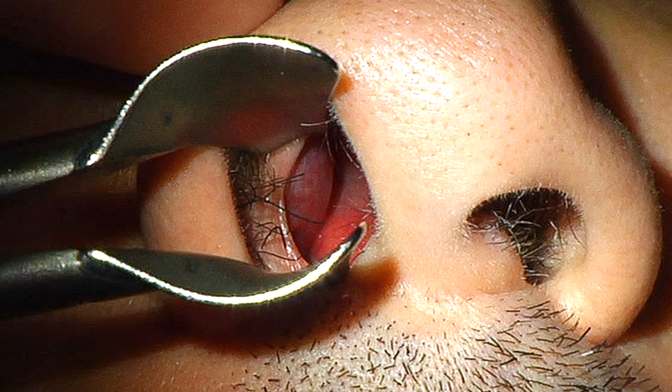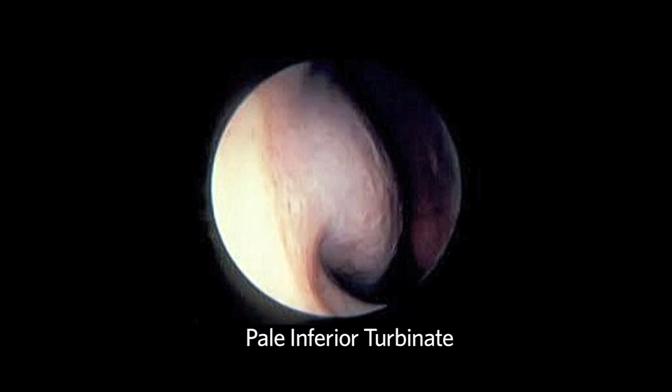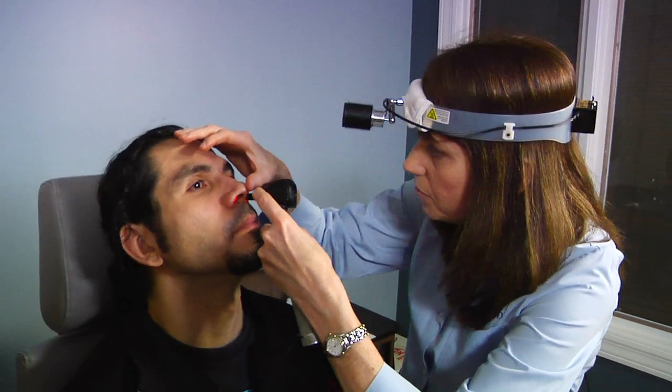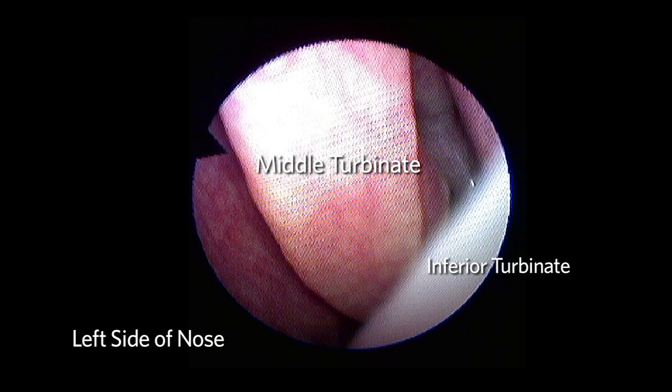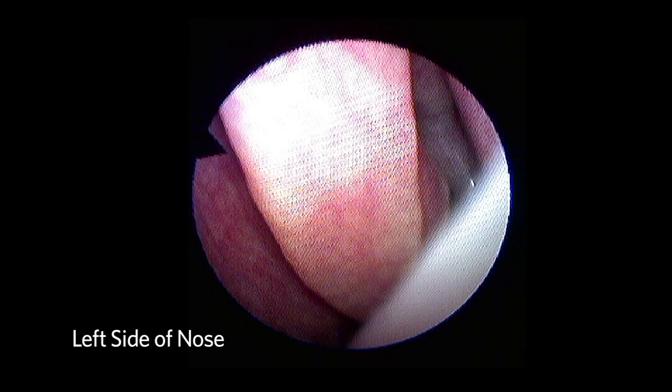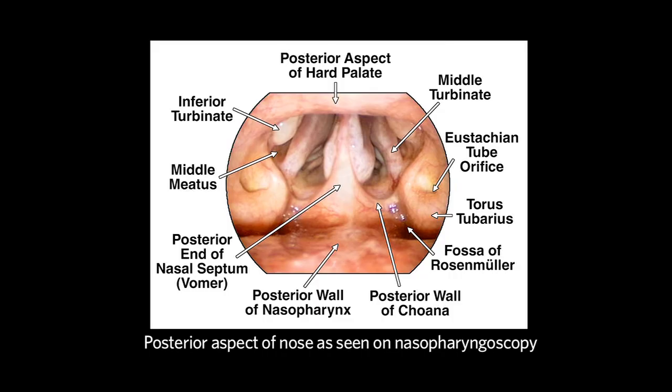The turbinates tend to be pink in color. If erythematous, it tends to suggest inflammation. If it appears pale blue, allergy should be suspected. If you use an otoscope with a large nasal speculum, one can often get a better view of the posterior aspect of the nose. This includes the posterior aspect of the nasal septum and the middle turbinate, which sits 30 degrees off the plane of the floor of the nose. The middle turbinate is more posterior and smaller in size than the inferior turbinate, and usually pink in color. If the inferior turbinates are very swollen and congested, one should spray a decongestant into the nose, which will allow better evaluation of the posterior aspect of the nose.